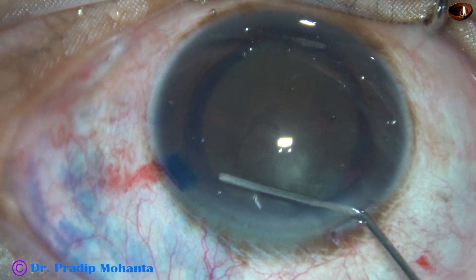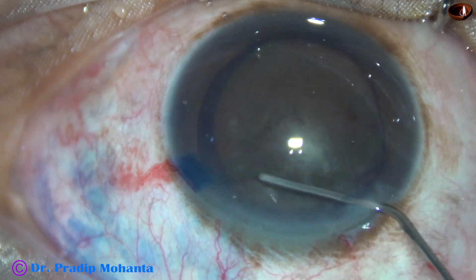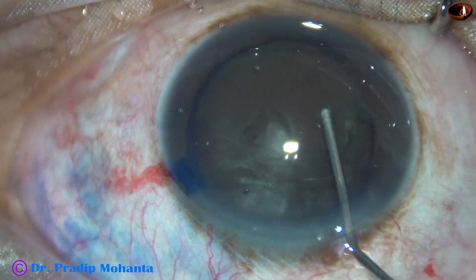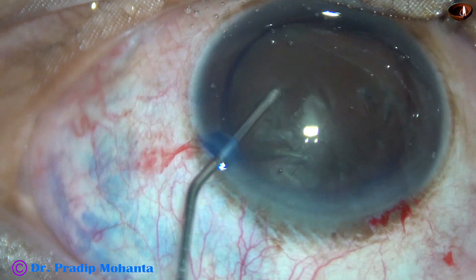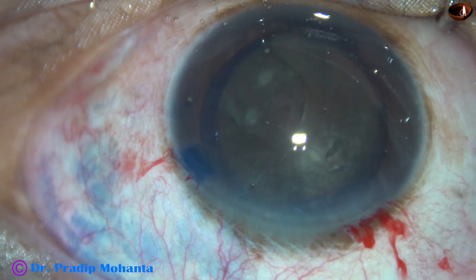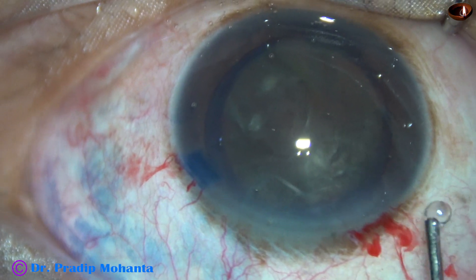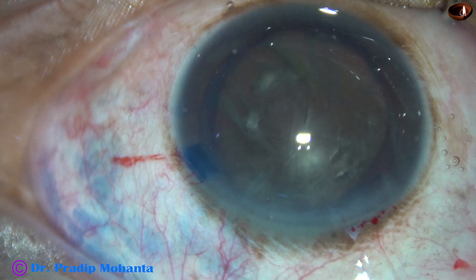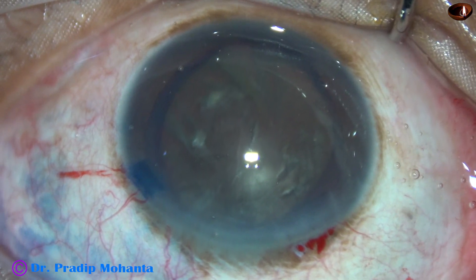Capsulorhexis has been done. This is a large rhexis as it is required for management of this black cataract. The nucleus rotates nicely after hydrodissection. Visco is injected — this is 2% HPMC. If you want, you can use chondroitin sulfate.